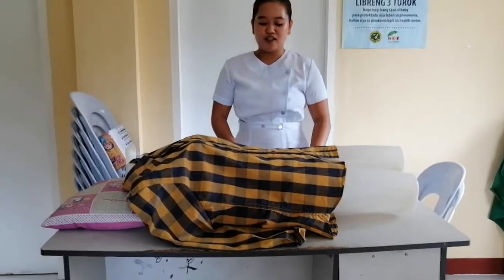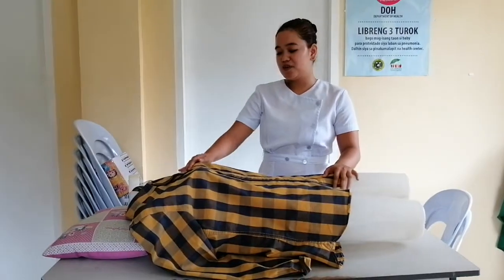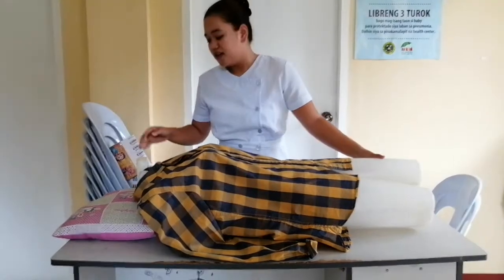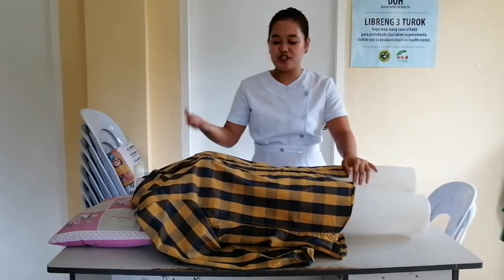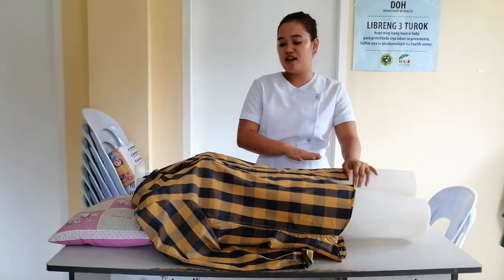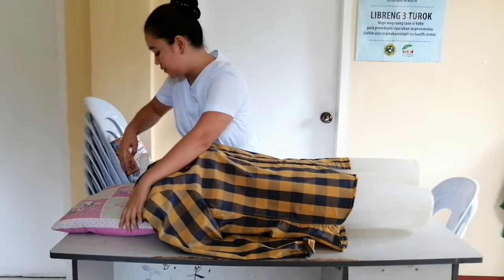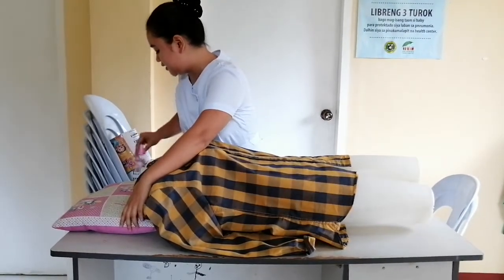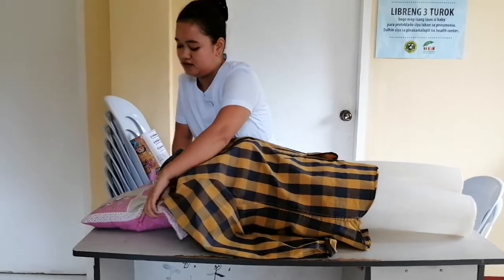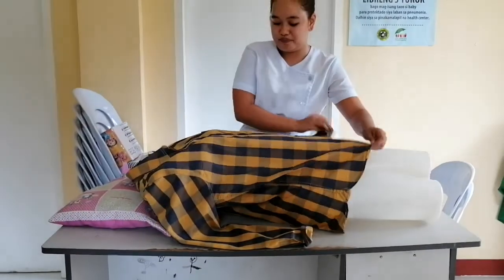And then after closing or providing privacy to your clients, you need to reposition the clients in supine position or in a comfortable position to provide comfort. In doing the ECG examination, the most appropriate position of the client is lying or supine position. So we need to support the base of the neck or the head. Then position the client in supine or in lying position.